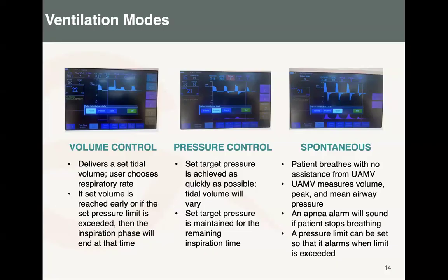So talking about the volume control, remember each mode that you select to work with has its own parameters that are specific to the mode. On the volume control, when you're ventilating in volume control, the volume will be constant and the pressure will be variable. So the parameter to set will be the tidal volume. And the tidal volume that you set is going to generate a certain pressure in the patient airway, depending on the compliance of the patient.